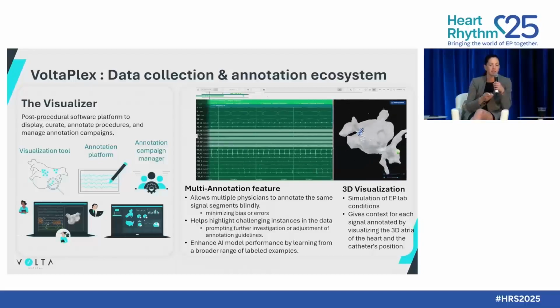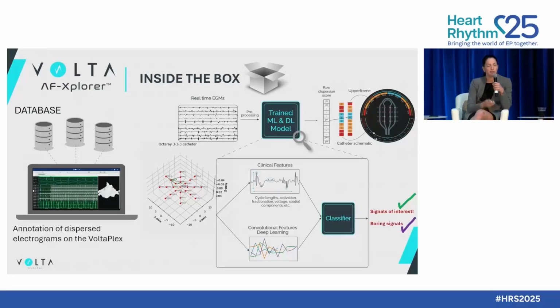Where are the termination sites, how do we visualize them? How do we re-annotate these signals then to teach the model? And then there's, of course, the machine learning model. That's the inside of the box.